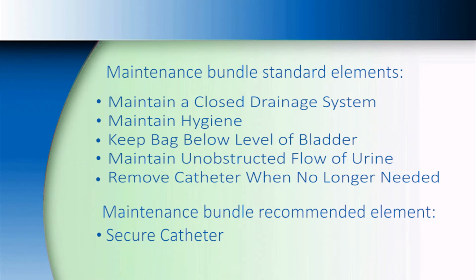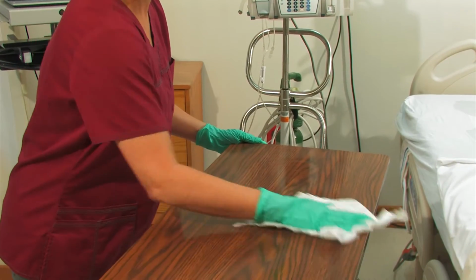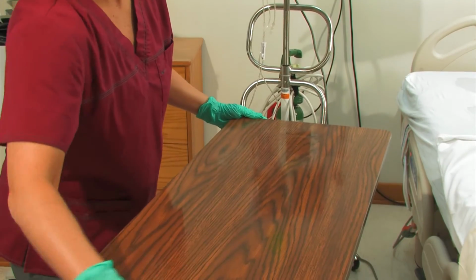For any of the procedures in this video, you should prepare a separate work surface and clean the surface with approved sanitizer prior to setting up for the procedure.